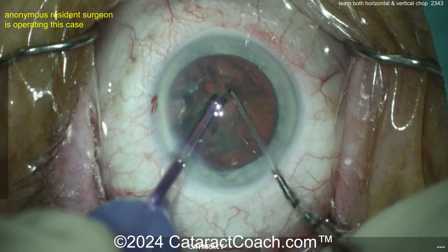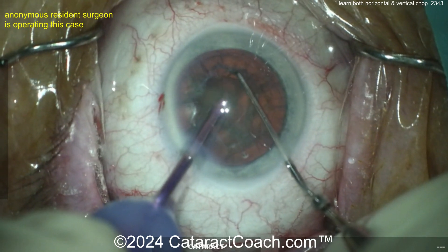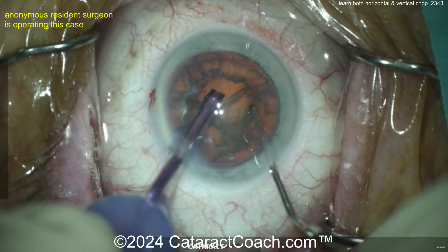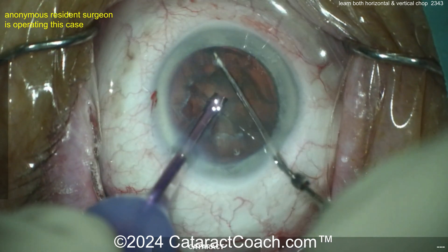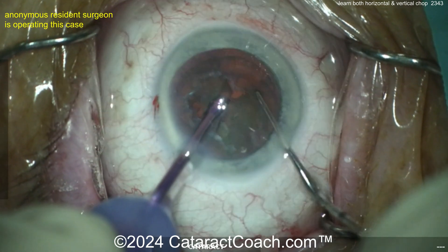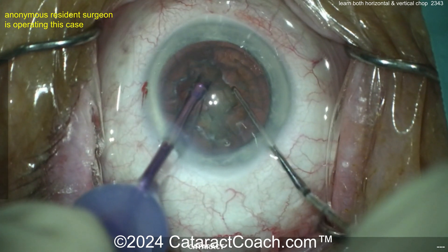I'll do my sound effects again. If the vacuum goes up — nee — chop. But if you wait and it goes back down, you've lost your vacuum purchase. So that window of opportunity to get a good chop is when the vacuum is high. When it goes nee, chop. Listen carefully to the audio clues from your machine.